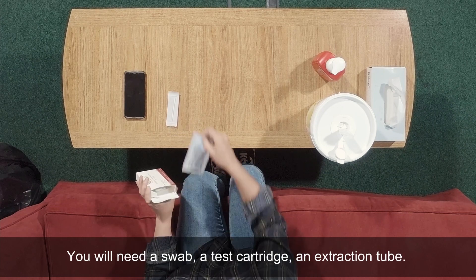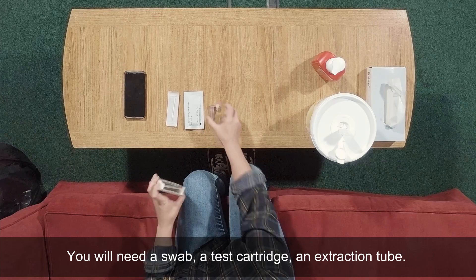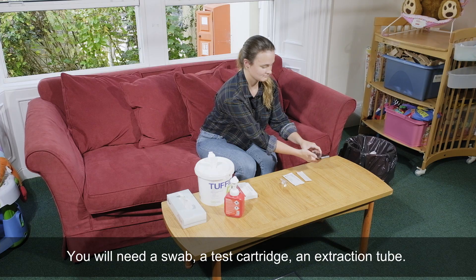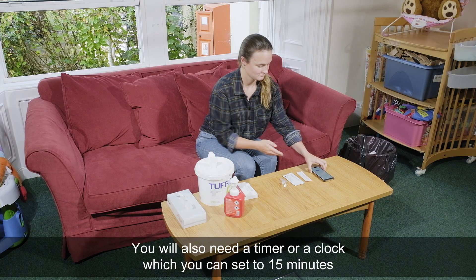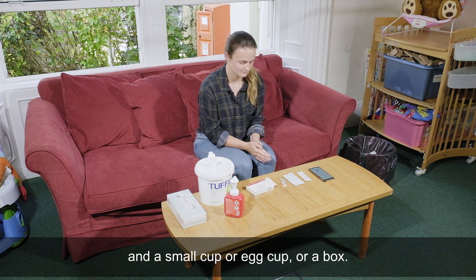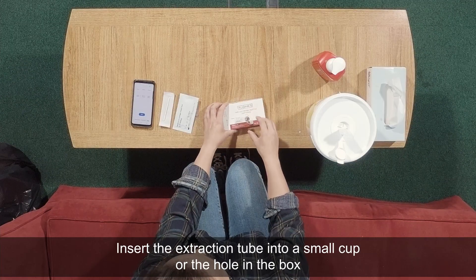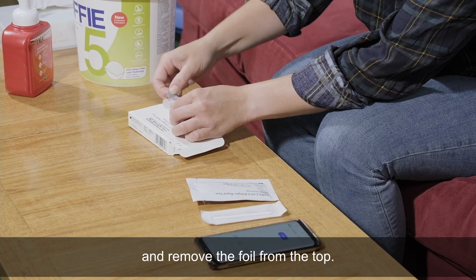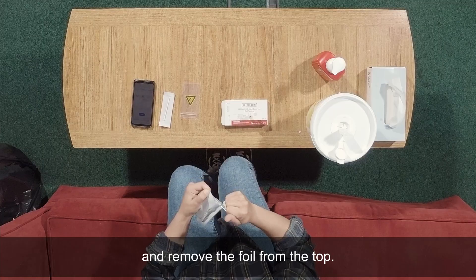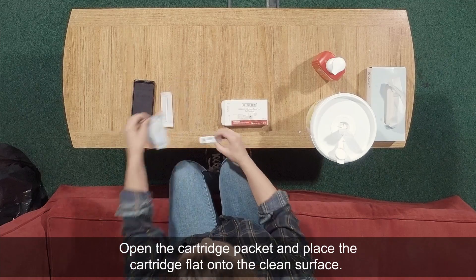You will need a swab, a test cartridge, and an extraction tube. You will also need a timer or clock which you can set to 15 minutes, and a small cup, egg cup, or box. Insert the extraction tube into the small cup or the hole in the box and remove the foil from the top. Open the cartridge packet and place the cartridge flat onto the clean surface.